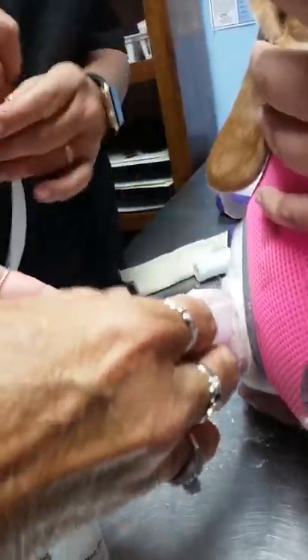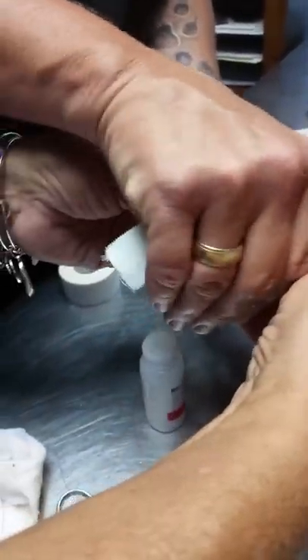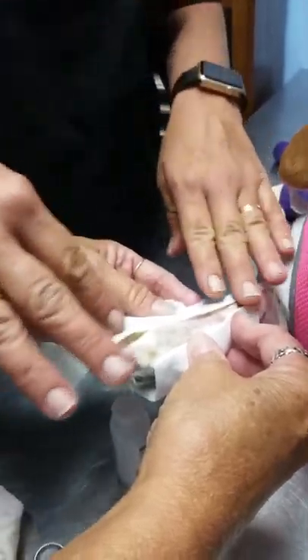Then what you want to do is make your stirrups, and you put them in a separate spot each and every time you do a bandage. Every time you change that, you do a new stirrup. Usually you go one on one side, one on the other.